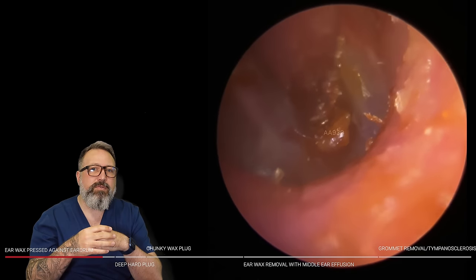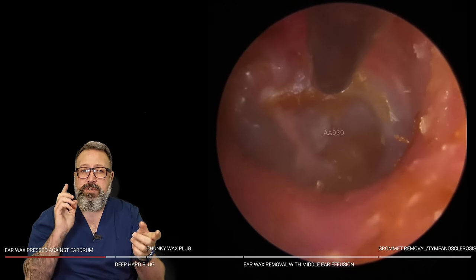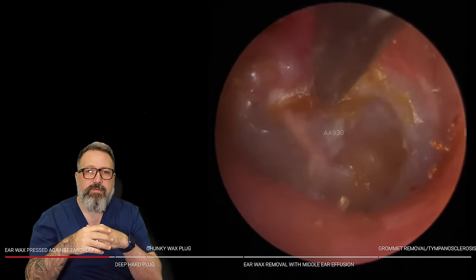We're just peeling away all of this old dead skin — there's all this keratin material here. We have got some tympanosclerosis as well, and we'll go through a little bit of explanation of that later on — it comes up in one of the videos later, so make sure you stay tuned for that one.